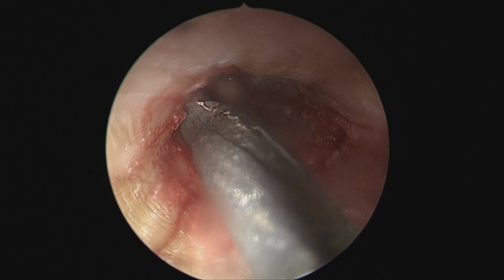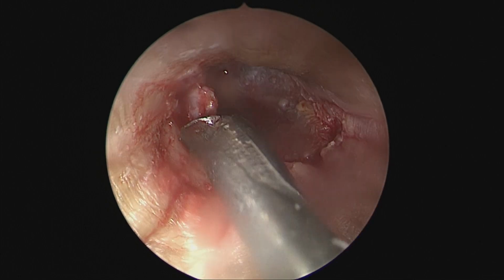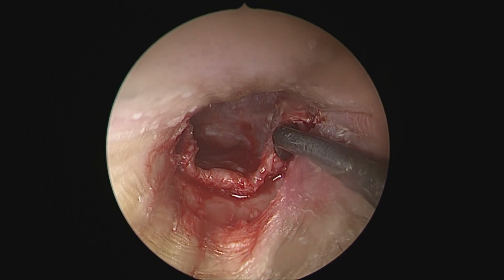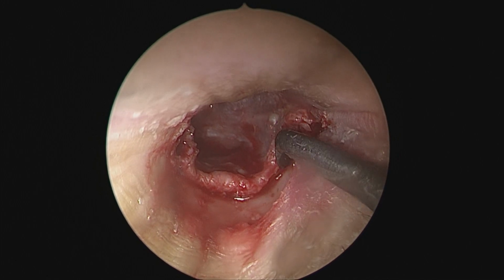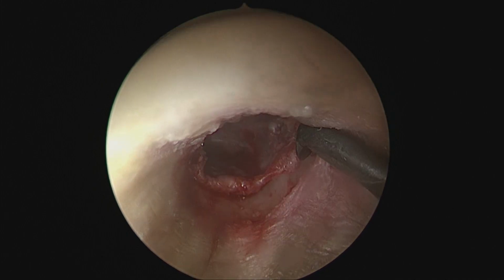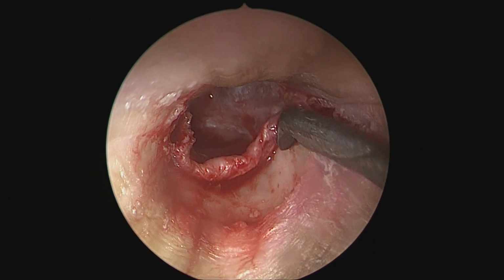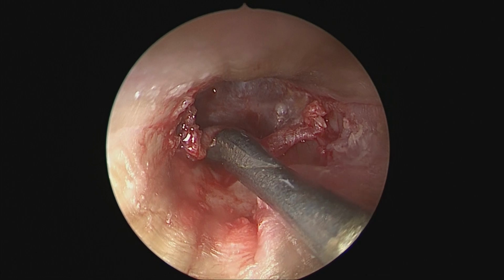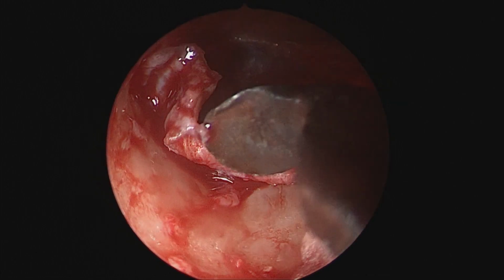In the preoperative examination, we could not see any annulus, so we categorize this as a marginal perforation with presence of granulation tissue and with a possibility of epithelium, which has to be explored during the surgery. There is a severe conductive hearing loss in this patient. And as you see, the mastoid was clear on the CT, and so was the medial attic, so we chose the completely endoscopic approach for this patient.